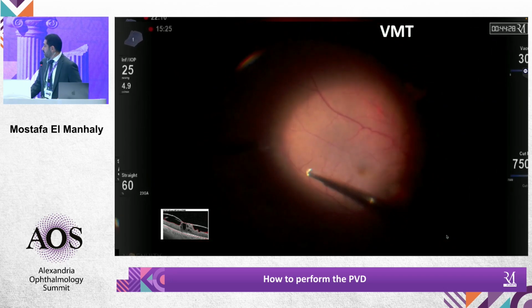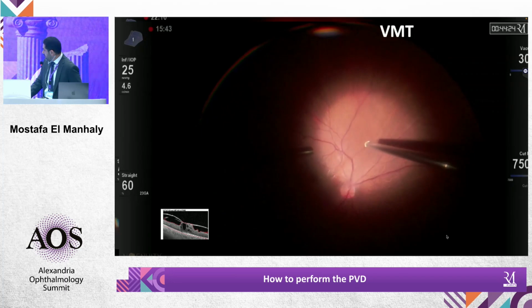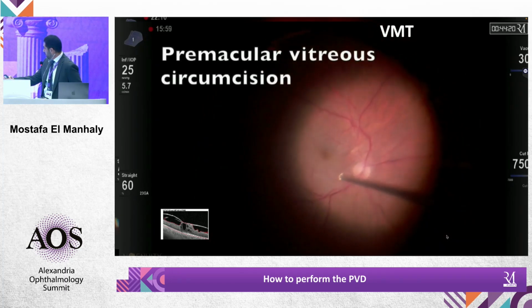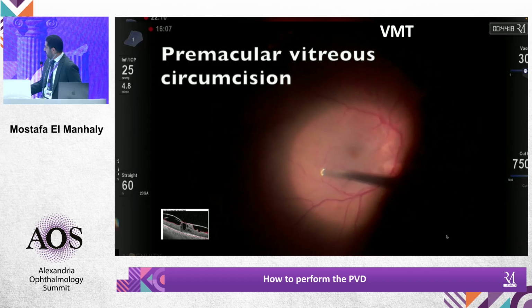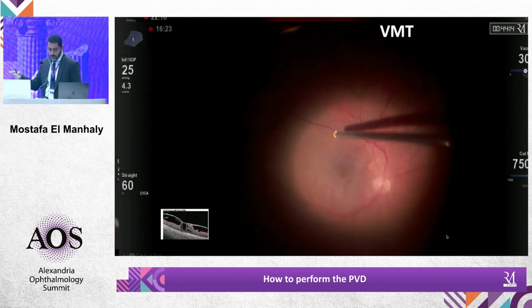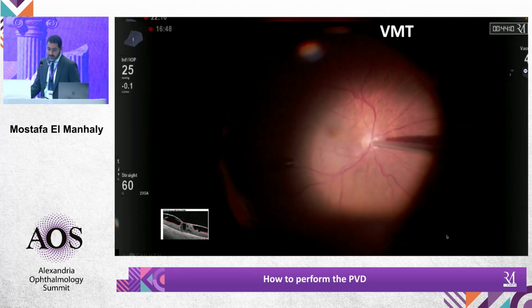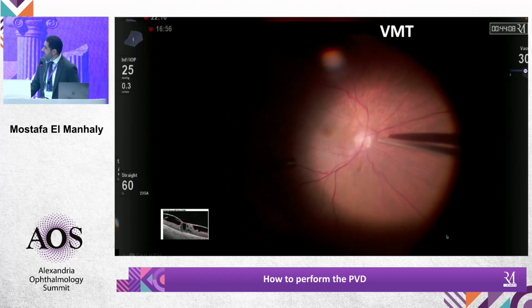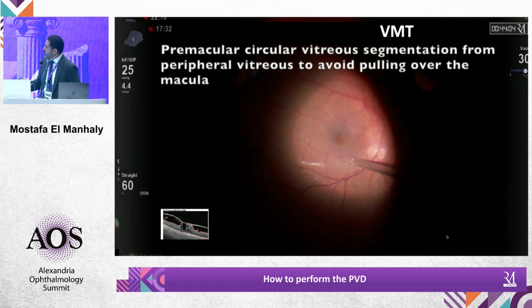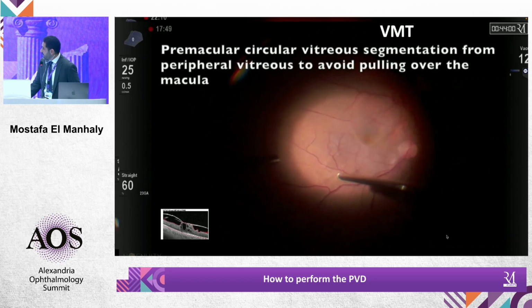Can I add something regarding the vitreomacular traction? Sure. I think the preoperative OCT is very important in those cases. I'm just commenting about detaching the posterior hyaloid. Next case for you, Dr. Moghazi. Dr. Ehab, this case is a vitreomacular traction with a central cyst and dense epiretinal membrane. So what is your advice or your modified technique in such a case?